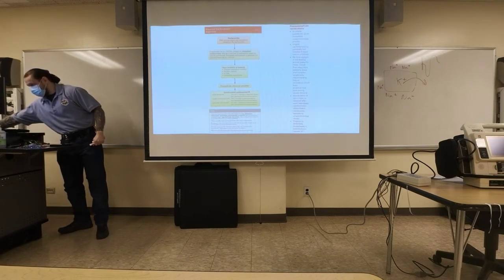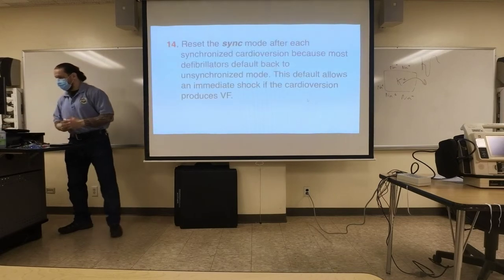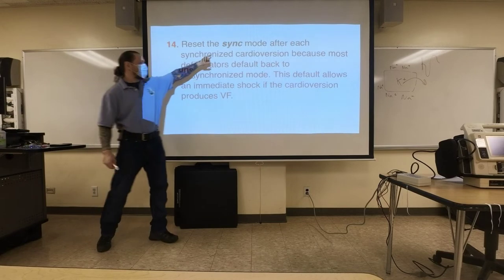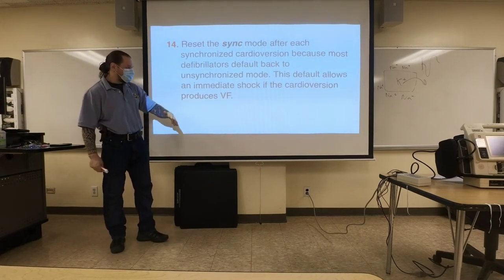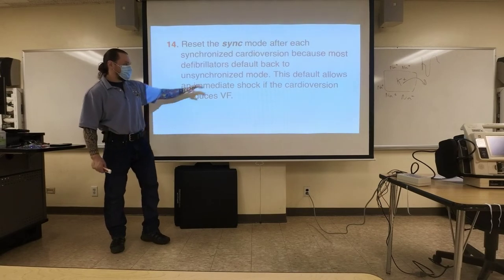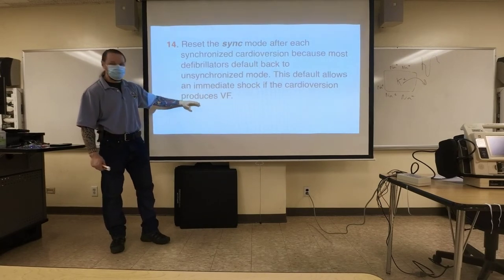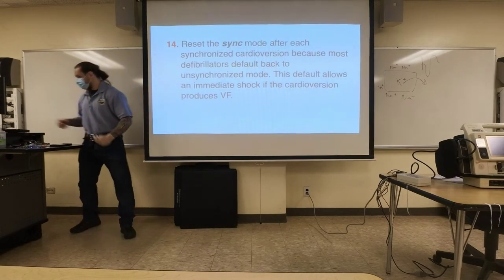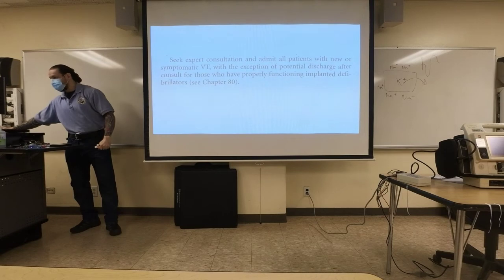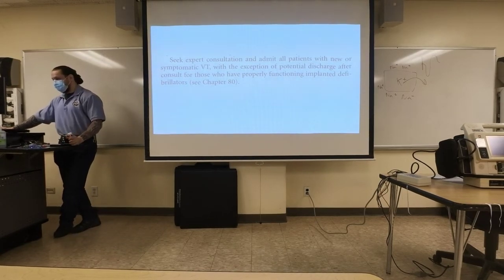What else is important to know? We talked about the synchronized mode. To engage it, they say you want to press the sync. It's very important to press this. Some monitors like this one will dump it, because it allows an immediate shock to be delivered in case there's a VF. This is why they have it. But know your equipment. The Philips won't; the Philips will keep it.